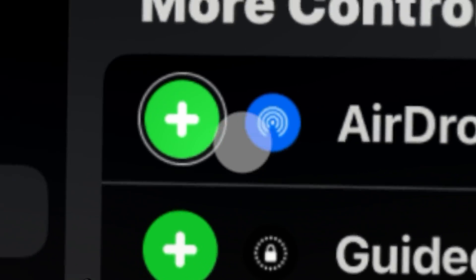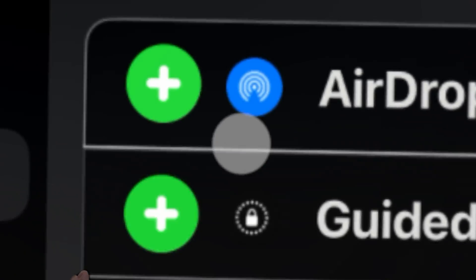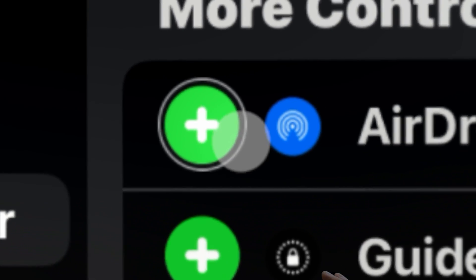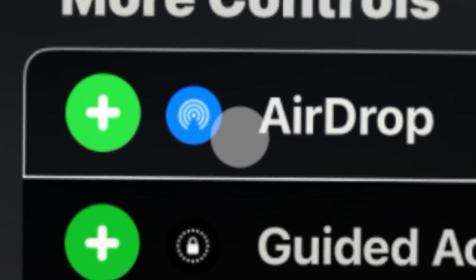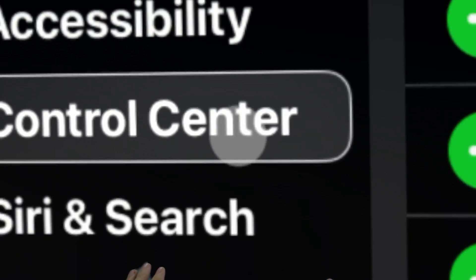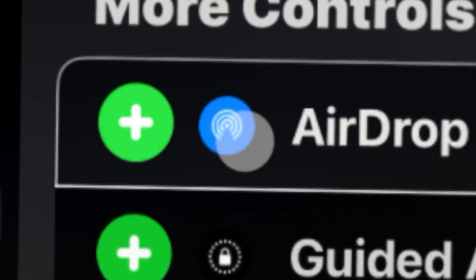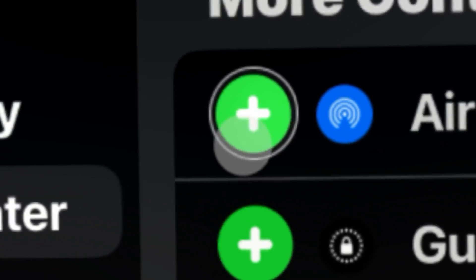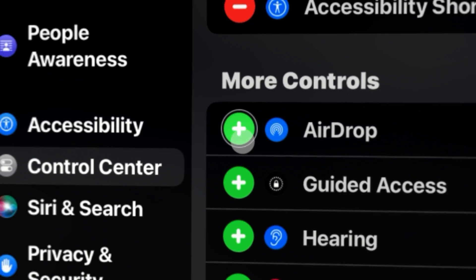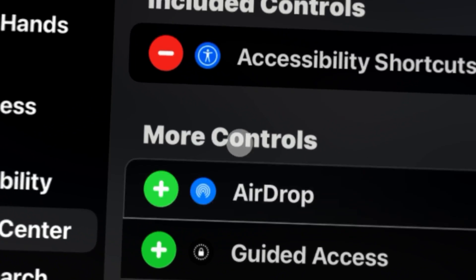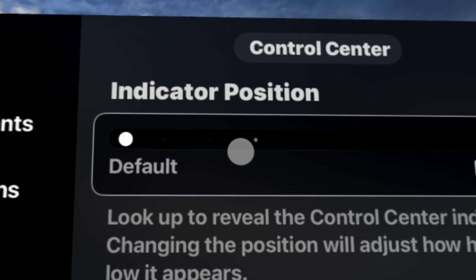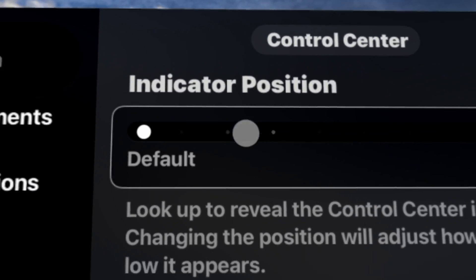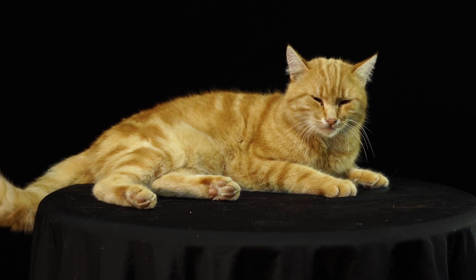When voiceover's turned on, things are kind of clunky. It's not very fluid. When it's turned off and you can utilize it this way, you're really getting the full power of the Apple Vision Pro and experiencing it like everybody else does. So let's jump in and start customizing some of this. I'm really blind, so I'm going to zoom in a lot.